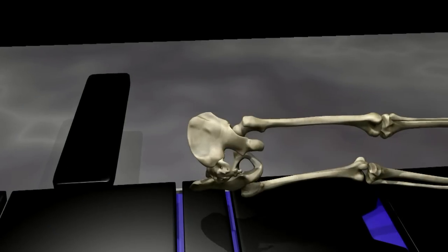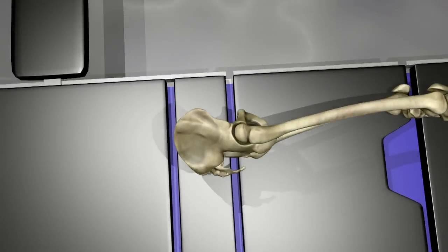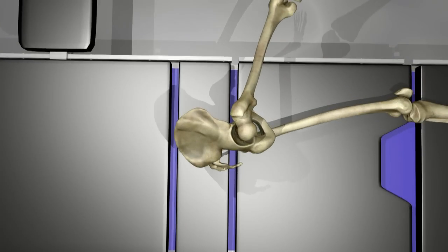The thigh is moved in such a way as to pull the femoral head, the ball, out of the acetabulum, the socket. The arthritic femoral head is then removed.